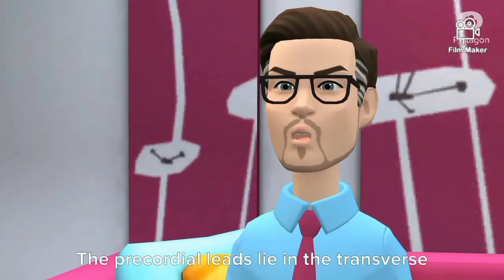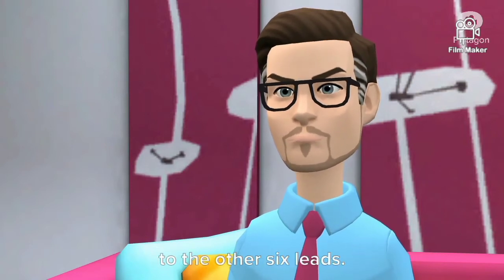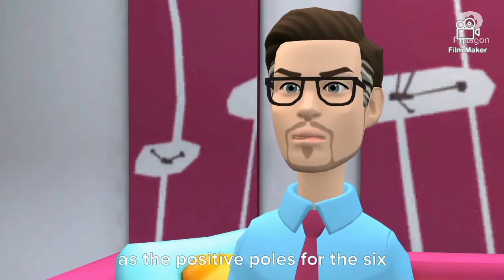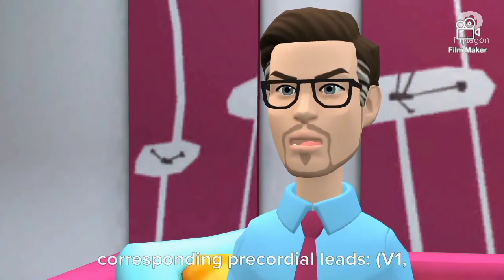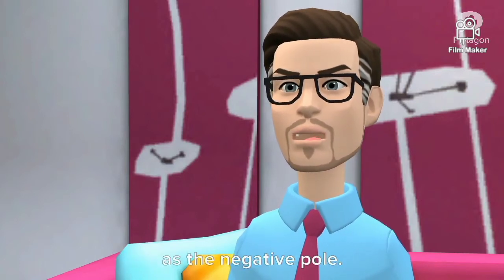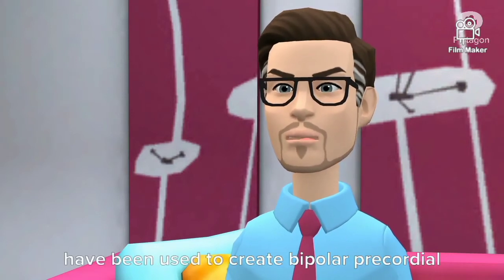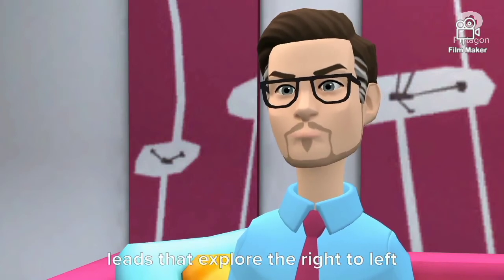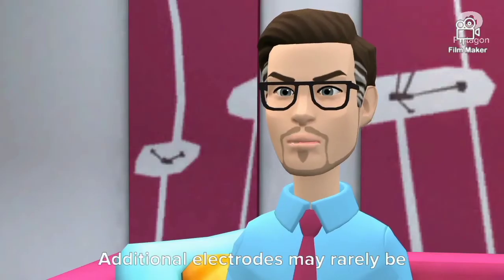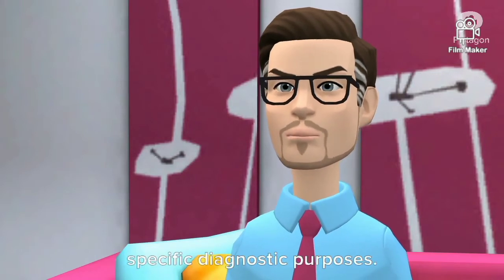Precordial leads. The precordial leads lie in the transverse horizontal plane, perpendicular to the other six leads. The six precordial electrodes act as the positive poles for the six corresponding precordial leads, V1, V2, V3, V4, V5, and V6. Wilson's central terminal is used as the negative pole. Recently, unipolar precordial leads have been used to create bipolar precordial leads that explore the right-to-left axis in the horizontal plane. Specialized leads. Additional electrodes may rarely be placed to generate other leads for specific diagnostic purposes.